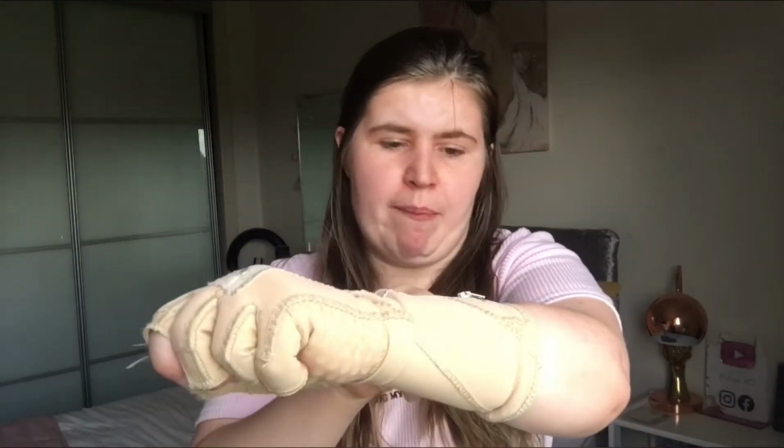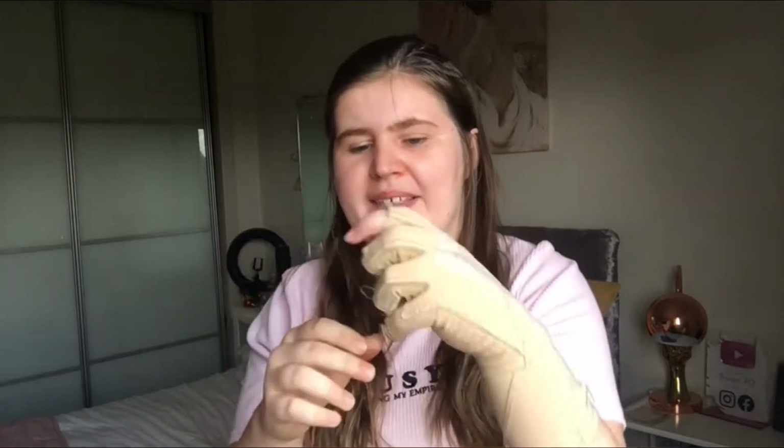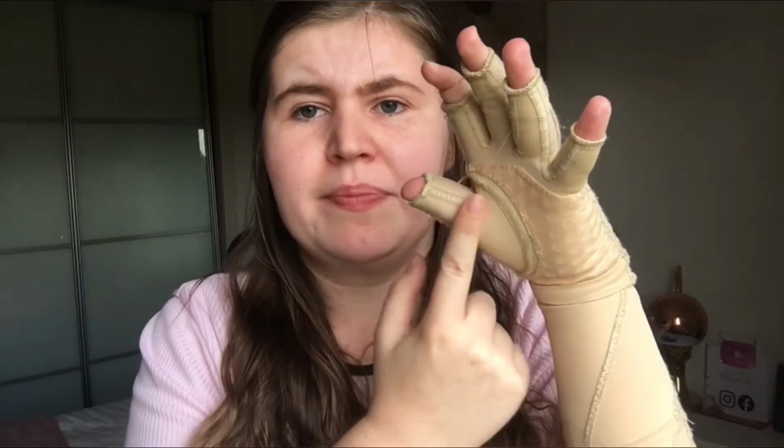The hand strap pulls back, so it pulls my hand in for my hand to get straight. Without it, when I'm relaxing, my hand can go like that, but when I've got it on, my hand just goes down. It's easier to go down because even though I haven't got much feeling in this hand, I can feel that I've got an item on my hand when I'm wearing it. I notice it more when I'm holding my hand like that, so I try to keep it straight, and that also helps. It does generally help straighten my hand out. That's my wrist and mainly this part here.